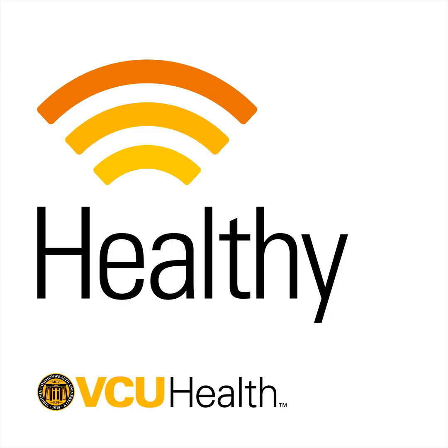So we deliver the energy in small bouts of about 10 to 15 seconds. And we call those individual energy deliveries a sonication. That's just the technical term for delivering sonic energy. And we do it in steps. So the first set of them are at a very low energy, just enough so that it shows up on an MRI picture that we're getting at the same time and can show us where the energy is being delivered.